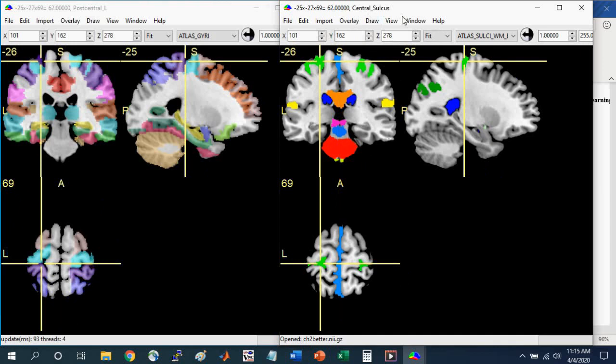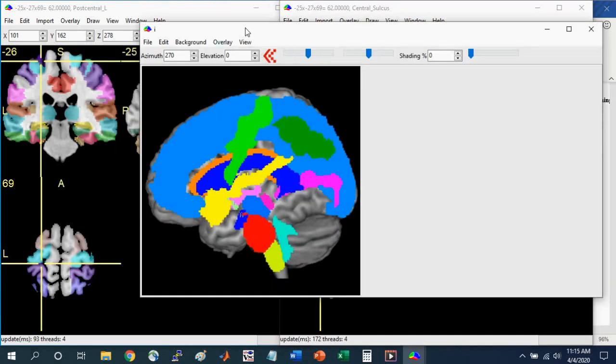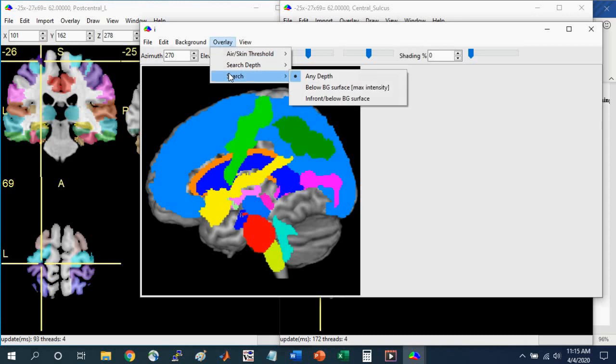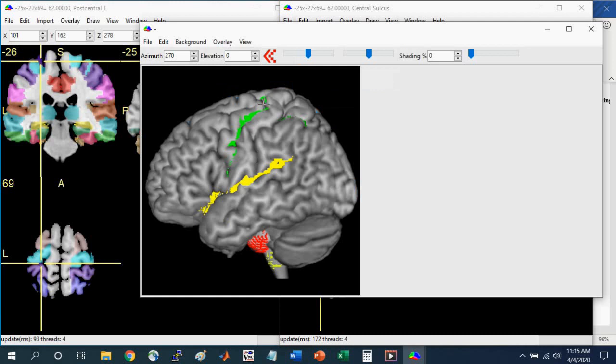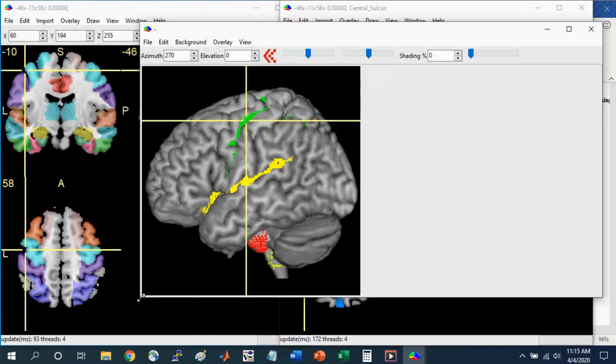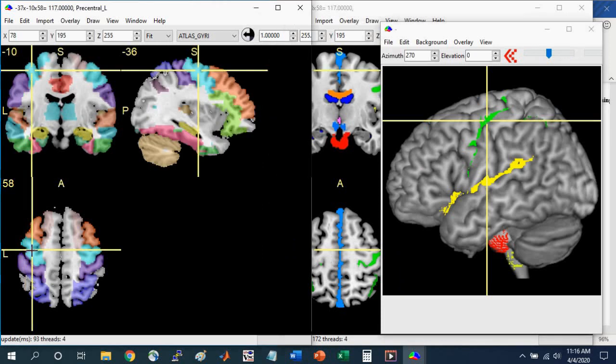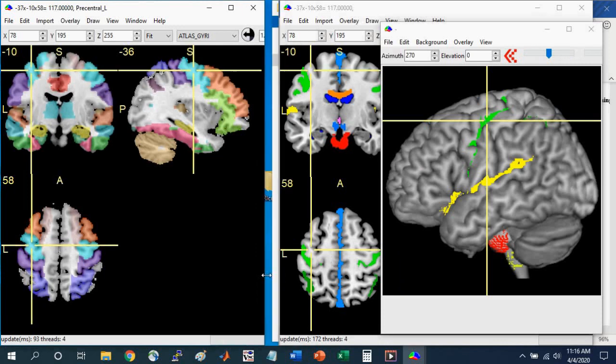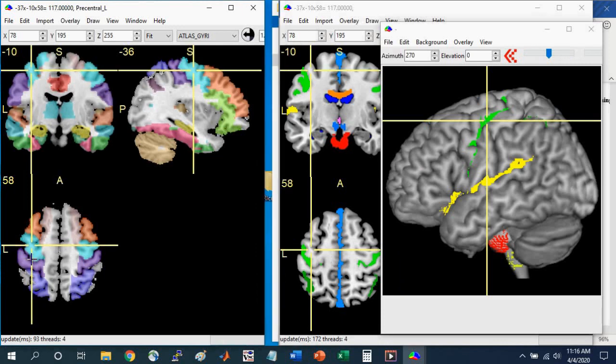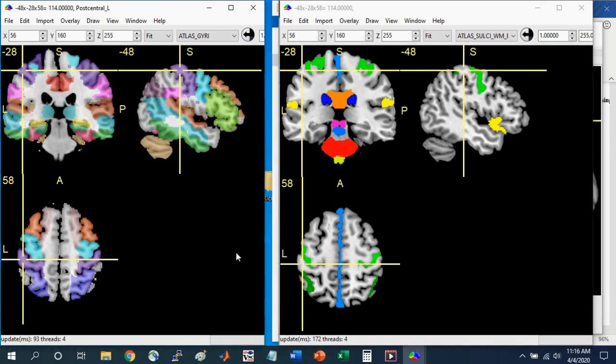To highlight the usefulness of having these two atlases open, I'm going to go to window render. I'm going to go to overlay, search, and select below the surface. It's only showing the regions that are 16 millimeters deep in the brain. You can see the central sulcus dividing this gyrus here and this gyrus here. If we look in the gyrus atlas, we can see the labels associated with these two different gyri. In teal you can see the precentral gyrus, and in purple you can see the postcentral gyrus. This is a way to use both atlases at the same time to learn these different brain structures and how they relate to each other.